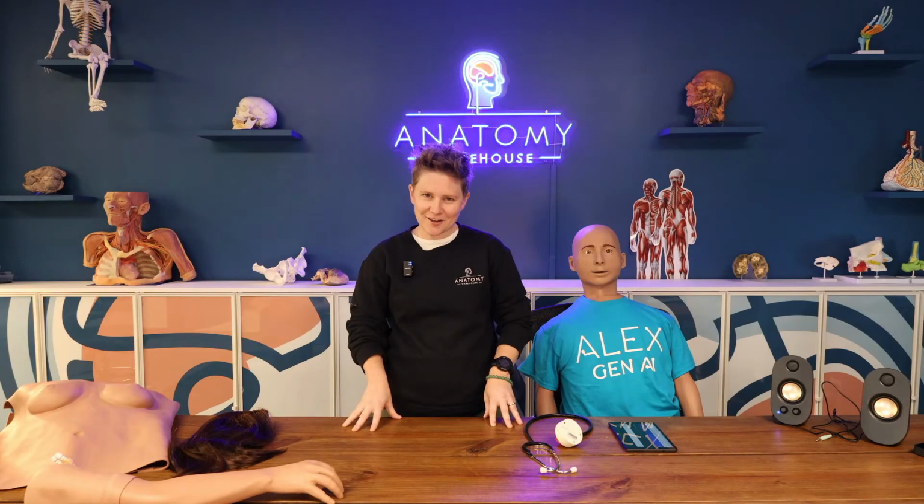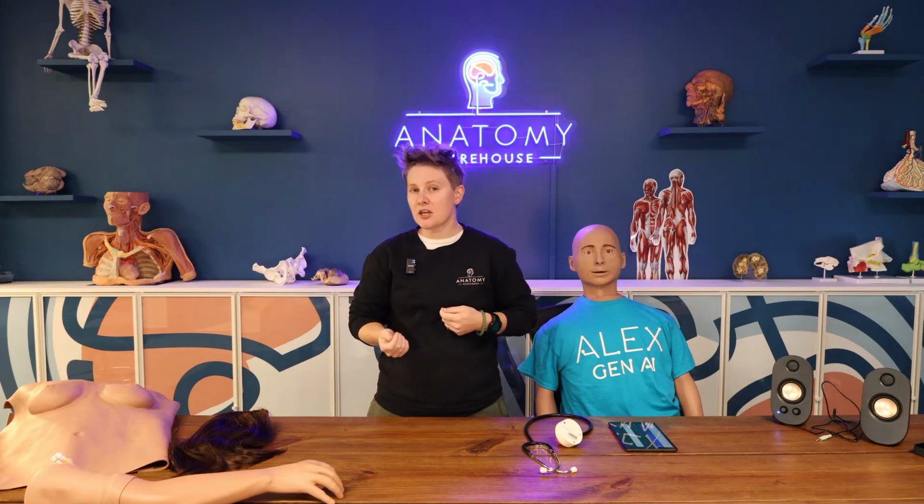At Anatomy Warehouse, one of our biggest priorities is supporting healthcare educators and learners with tools that deliver the very best learning experiences. While mastering clinical procedures is critical, we know that the human side of healthcare education, specifically communication between patients and caretakers, is just as important as learning how to do IV, CPR, intubation, and all the good stuff. For too long, simulating that soft skill between patients and caregivers has been really difficult in a learning environment.